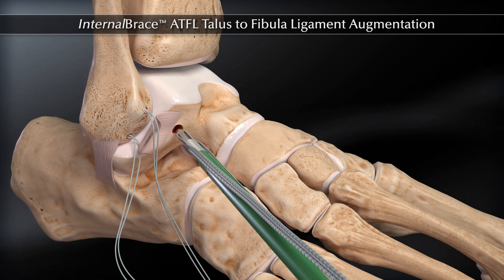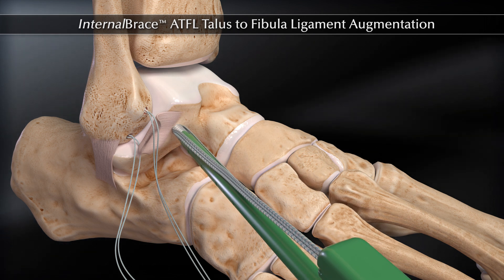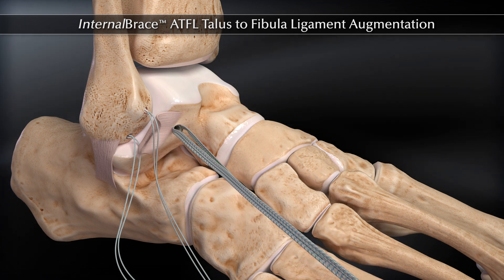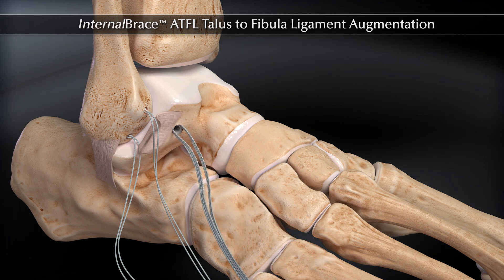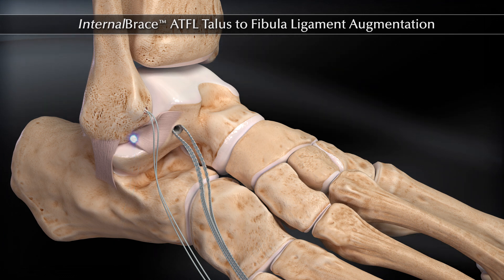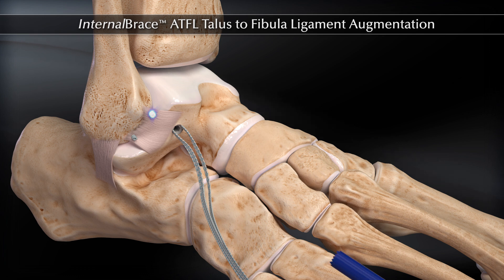Insert the 4.75 mm swivel-lop preloaded with fiber tape into the talus hole. With free needles, pass the fiber tape through the ATFL. You will then tie down the ATFL to the fibula using the Broström technique.